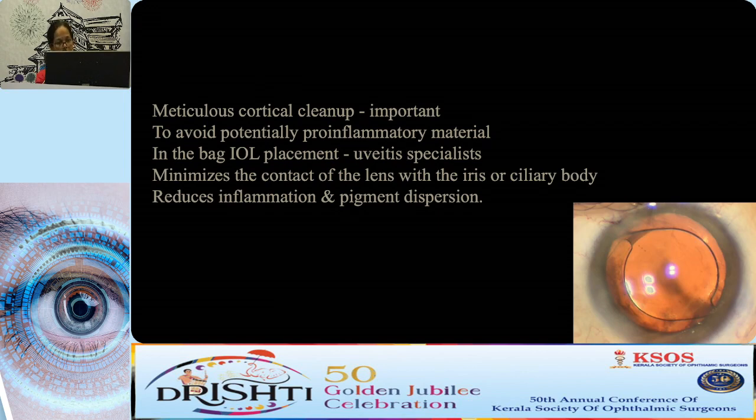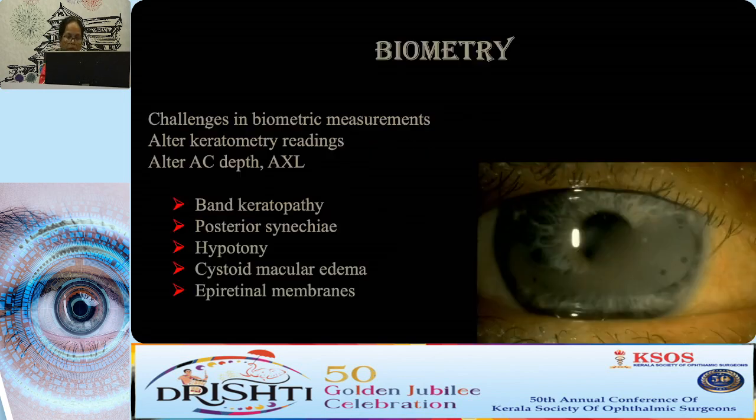The IOL should be placed in the bag. That is the preferred practice by uveitis specialists. It minimizes the contact of the lens with the iris and ciliary body and thus reduces inflammation.